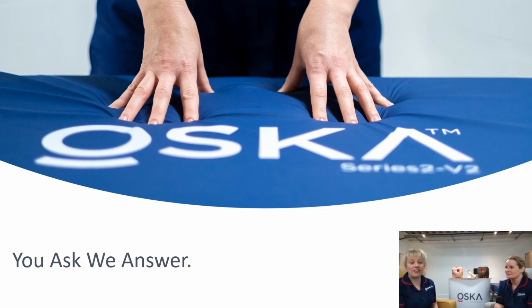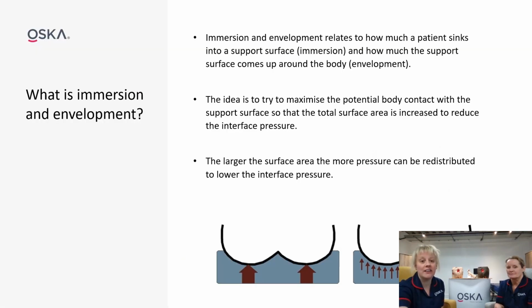So let's have a look at another of the questions that's come through to us. And this question is, what is immersion and envelopment? Well, immersion and envelopment really is about the ability for a patient to sink into a surface. So that's immersion, when somebody sinks into the surface, and you can see that from one of the pictures there on the screen. And the reason we want someone to sink into the surface is so that we increase the surface area for pressure to be redistributed on, and we want to try and maximise the amount of body contact with the support surface in order to do that.